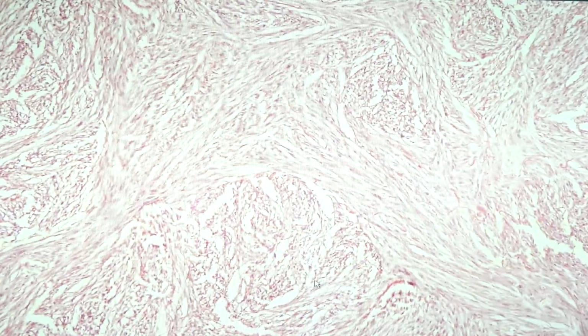In some of the books, if you read them, they would say herringbone pattern is very characteristic for fibrosarcoma. It simply means you have to look for areas that assume a bone pattern typical for the fish.